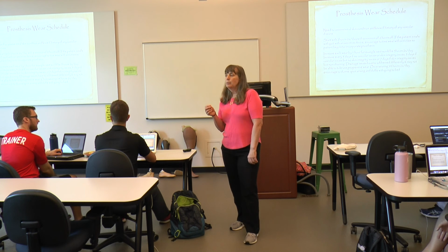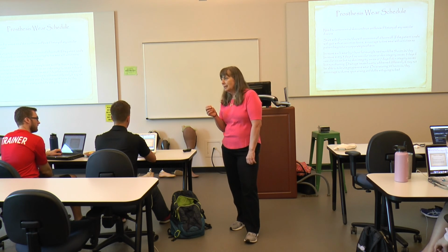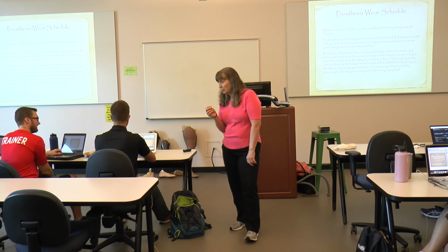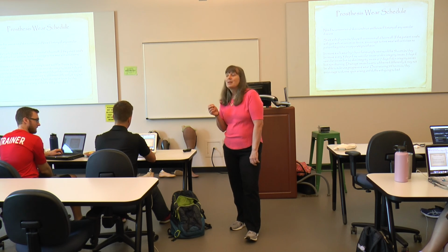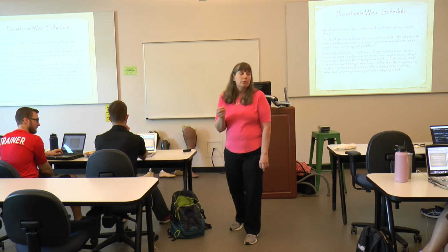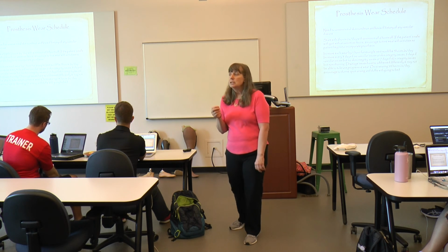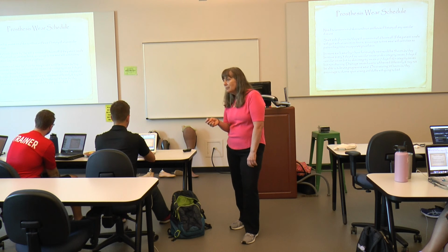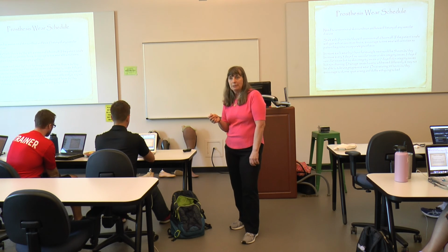Have any of you ever worn a pair of shoes and your feet were killing you by the time you got home? And if I'd asked you to put that pair of shoes back on to go out tonight, you better be going to a very good restaurant because you are not putting that pair of shoes back on. All right? That's kind of limb pain I'm talking about. So they're rolling these liners on and cringing and their leg is hurting. You are not ready to go up. We don't go up even though the time's there.